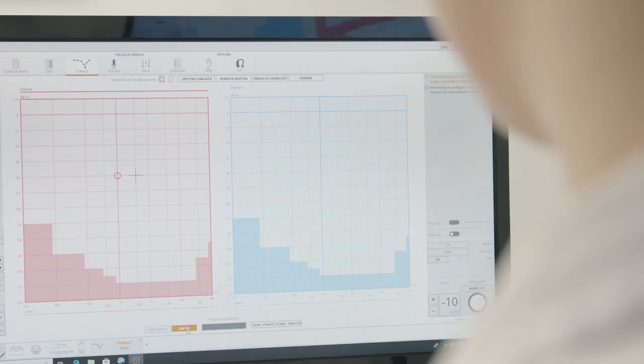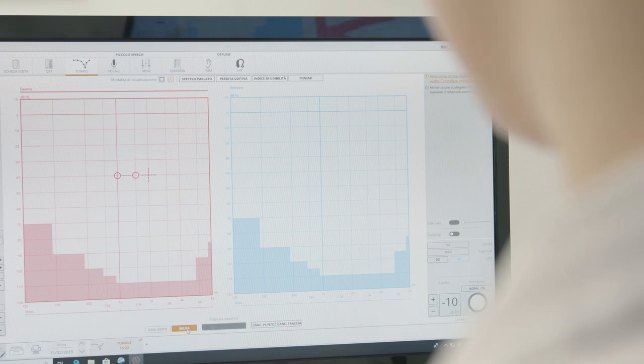I'll now show you how the PC interface looks and can be controlled. We'll have a look at the available settings and at how simple it is to carry out a pure tone and a speech audiometry test with Inventus Piccolo.